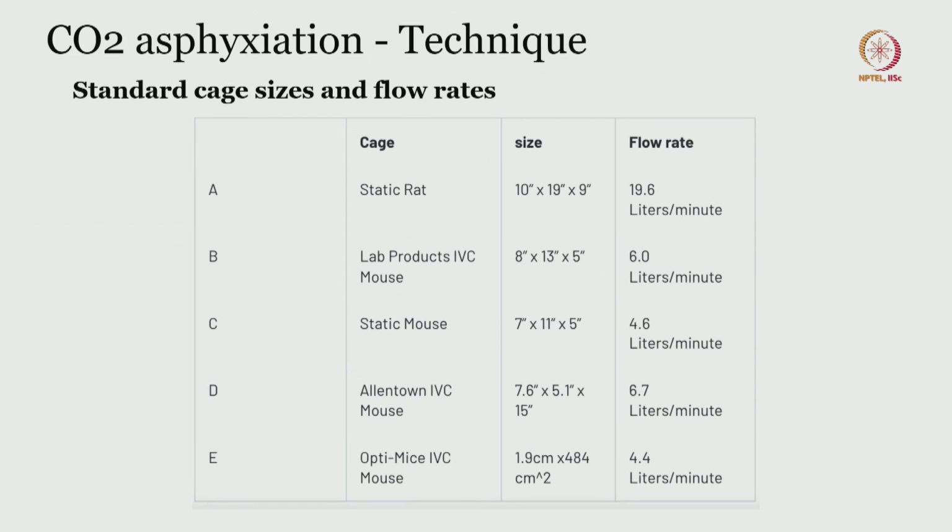It's very important, as I said earlier, carbon dioxide being heavier than air, incomplete filling is very common, and rats can escape by avoiding coming in contact with the carbon dioxide, if the chamber is bigger and your flow rate is inadequate and the concentration is inadequate.